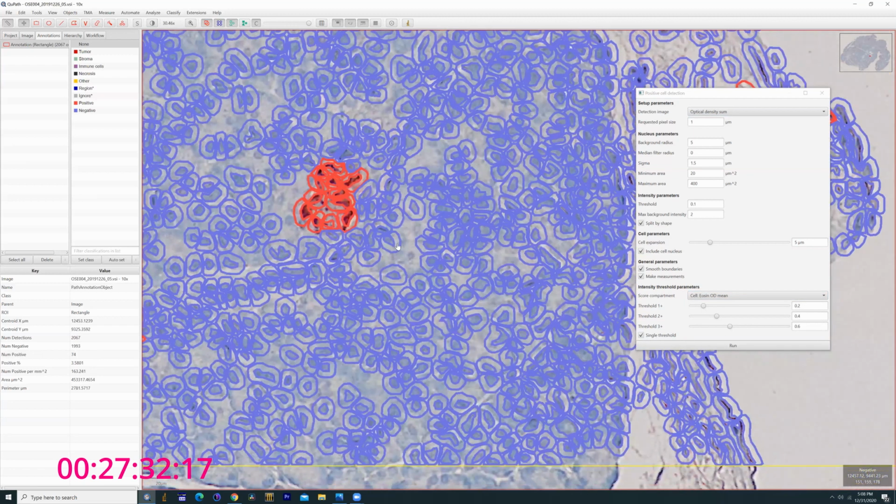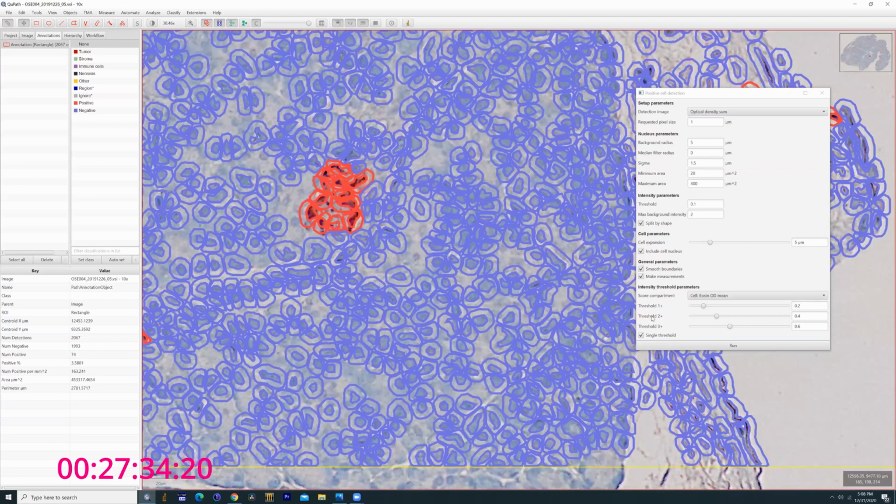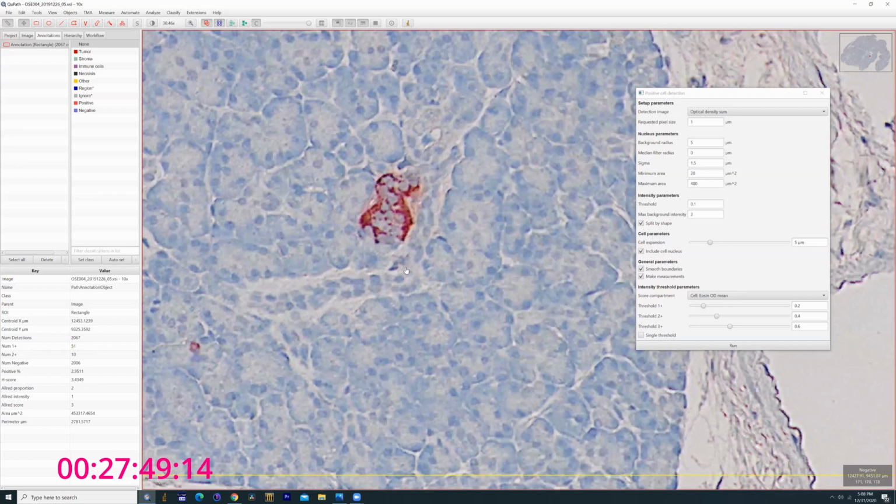As you can see, it highlights the things that are above those thresholds. In this case, the default color is red, but if you uncheck the single threshold, it'll actually generate a gradation based on relative intensity. So we hit run. So in this case, here, we hit D.